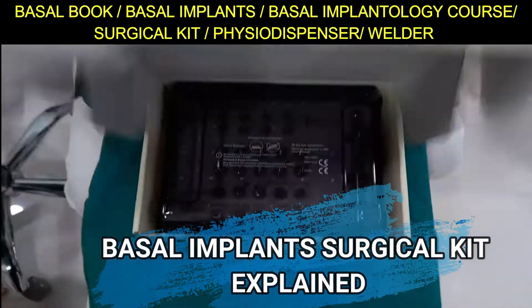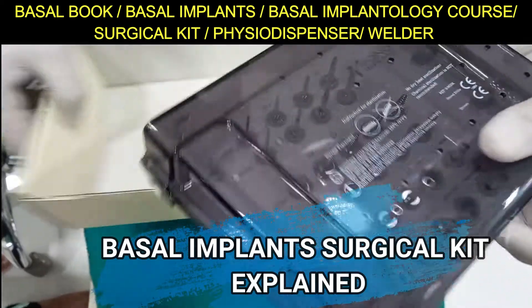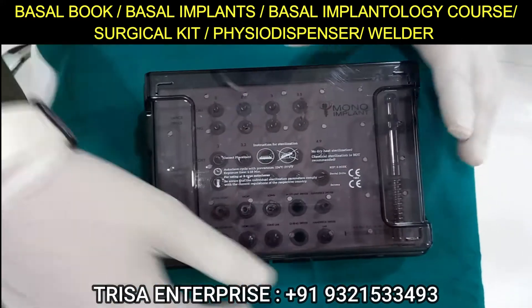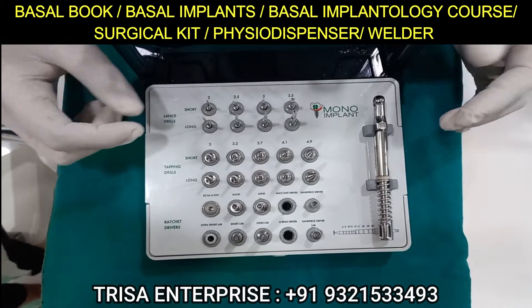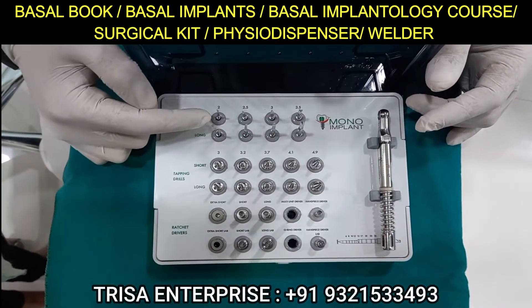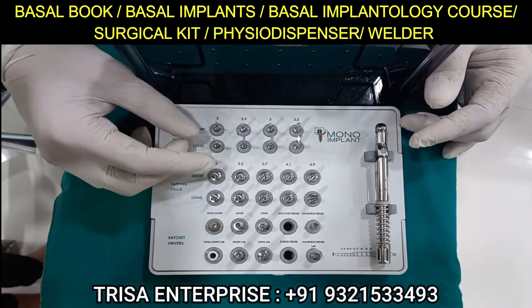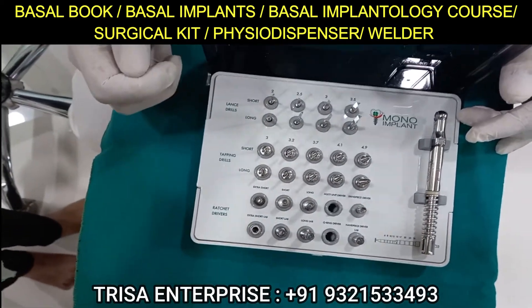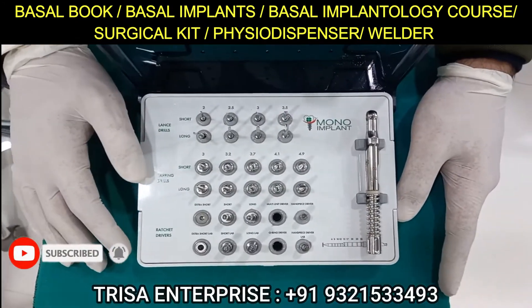This is a mono implant autoclavable sterilizable surgical kit box. The drills are arranged as short and long — the short drill is 20mm and the long drill is 30mm. Both drills have a stopper, which is a protective feature so you will not end up going beyond 30mm.